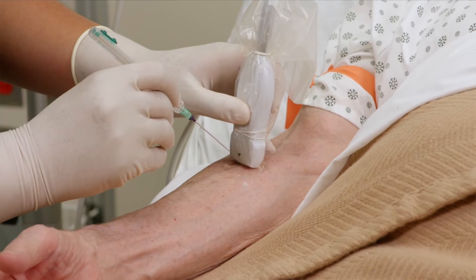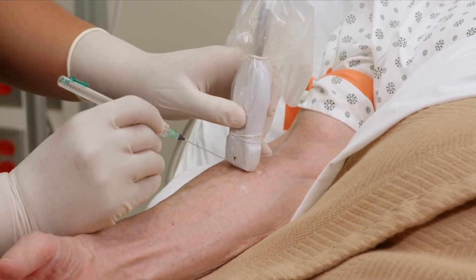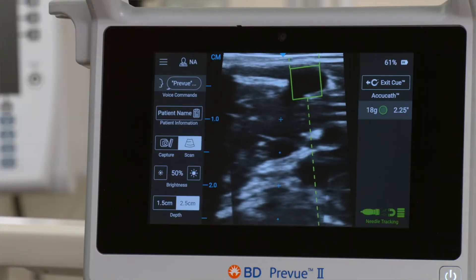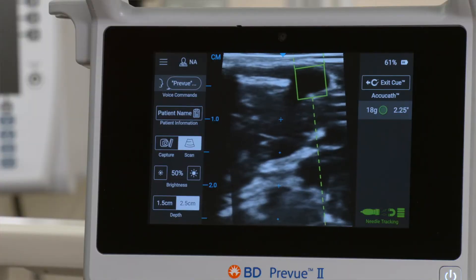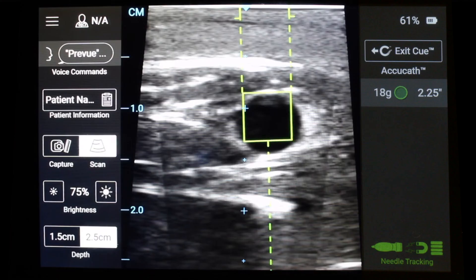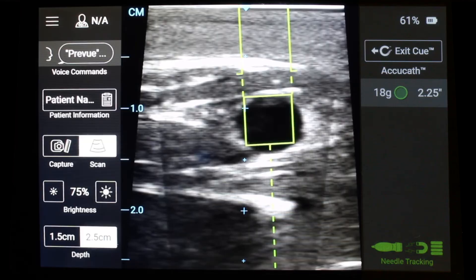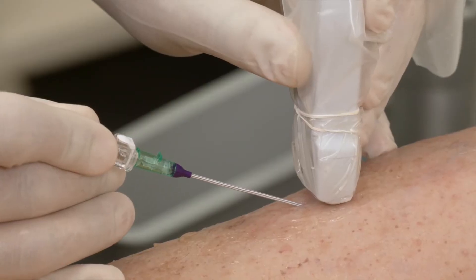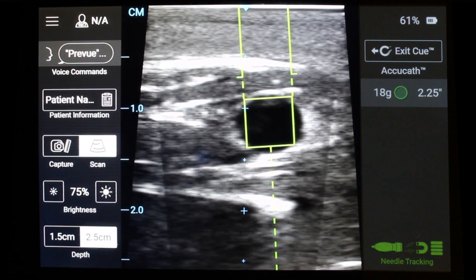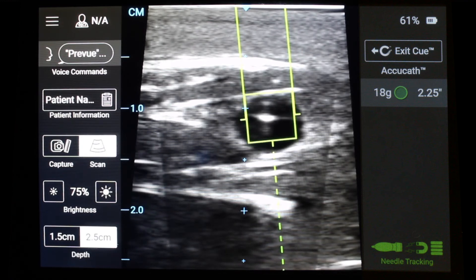Before inserting the needle, adjust the needle angle and distance from the probe to align the target box with the vessel. Once aligned, begin inserting the needle. The solid needle lines will advance down the screen as you advance the needle. Continue to advance your needle into the vessel. As the solid needle lines pass through the target box, the needle flash should appear inside the target box.